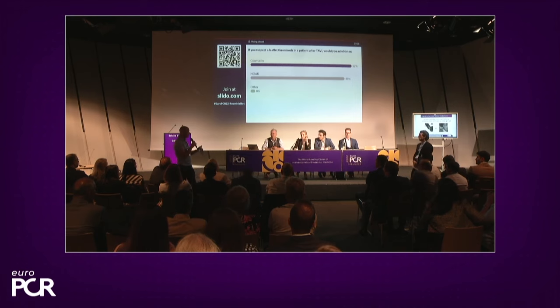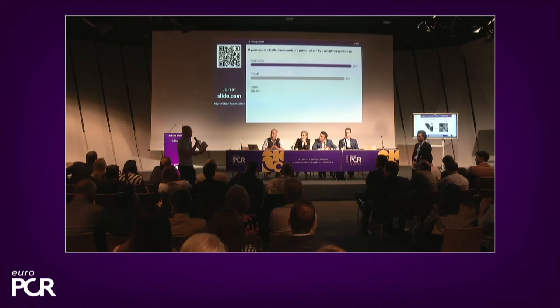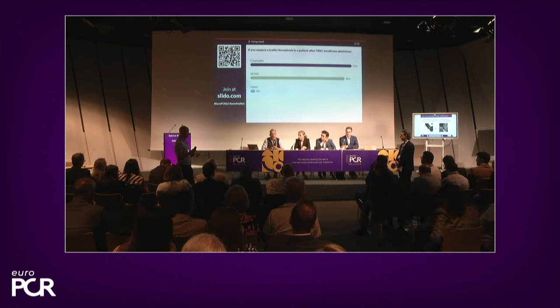Okay, maybe we quickly go through a couple of scenarios in younger patients. So what would be important, or what would be your perspective? For instance, in terms of paravalvular leak in younger patients, what is the rate of moderate paravalvular leak that you would allow, Sabine? Would it be 5%? Would it be 10%? It must be 0%, I would say. I think we all agree that moderate leakage has an impact on survival and on outcomes, so we have to avoid it completely.